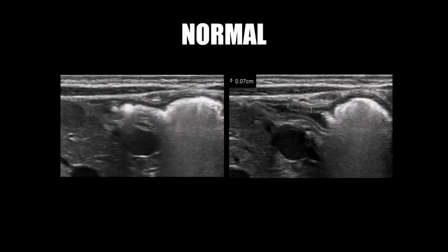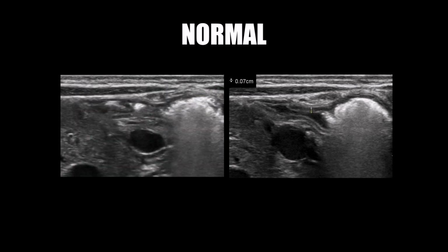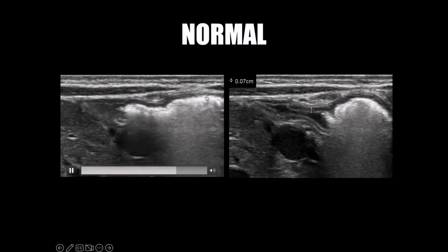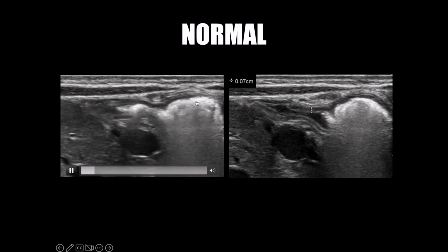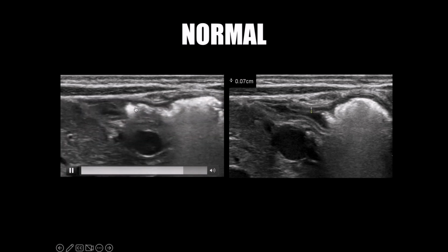We'll look at just a couple more examples of normal and abnormal. Here we are again, normal pylorus, easily viewed transpyloric flow. You've got this hyperechoic gastric content. This is owing to a whole bunch of admixed air into this, and you've got this dirty shadow coming from that air, but you can see this content freely passing out this pyloric channel here into the duodenum.